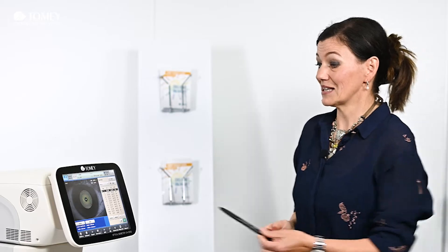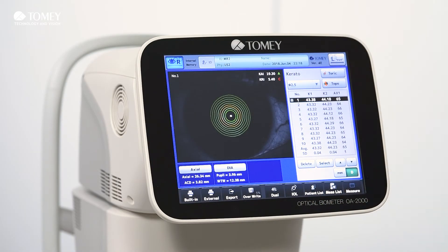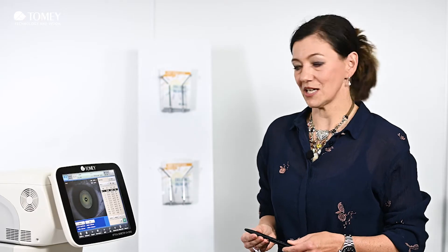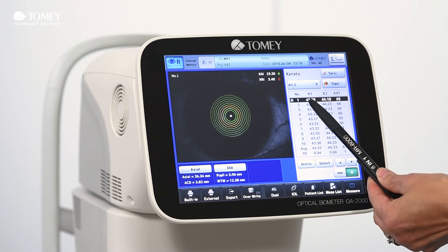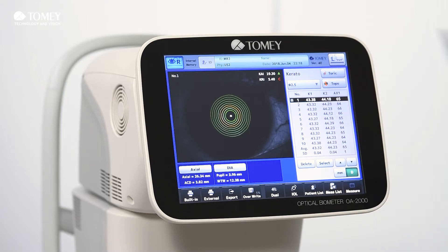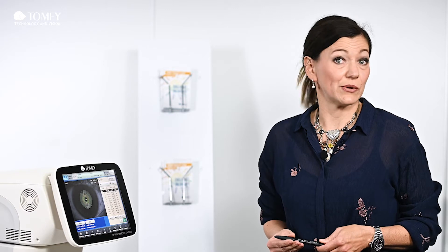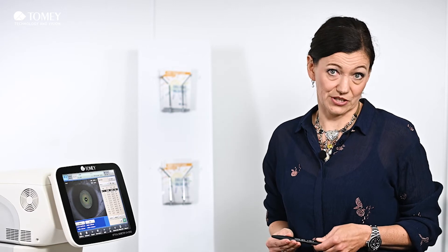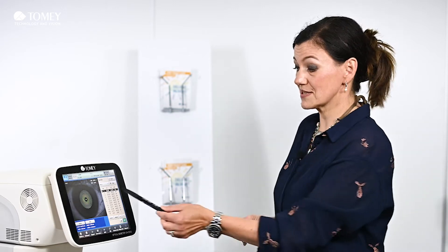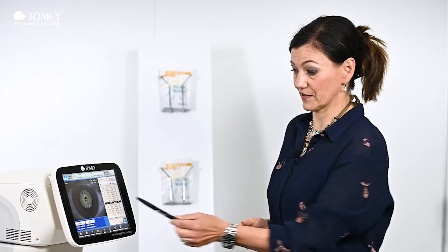In this measurement you get your standard k-readings. Here you can see all of them, and then we take the average for your IOL calculation, if you do not select them individually.